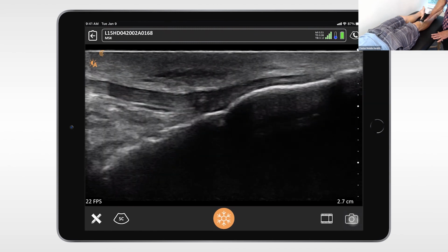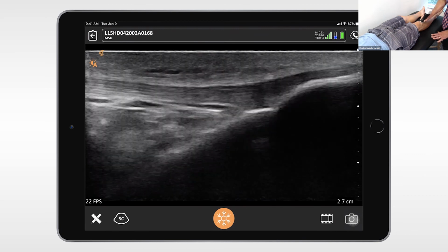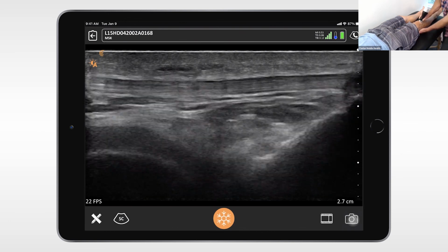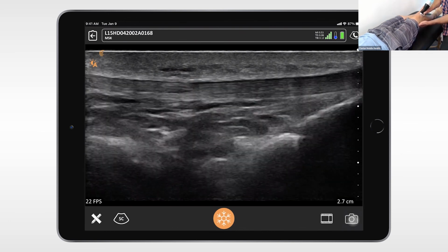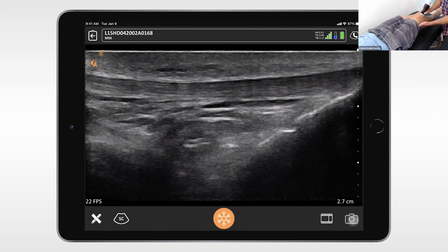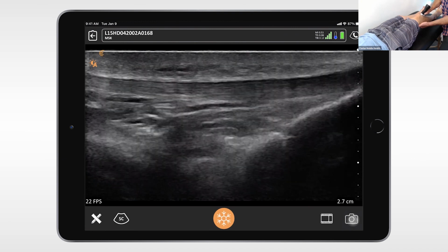Yeah, fantastic. If you want to improve the image of the patellar tendon a little bit, then you can apply a little bit more knee flexion. So a little bolster underneath the knee will stretch the ligament. And with this, the image quality will be better. But your technique of moving is great. It's good. Yeah, beautiful. Yeah, this is better.